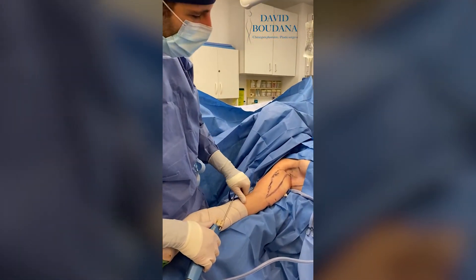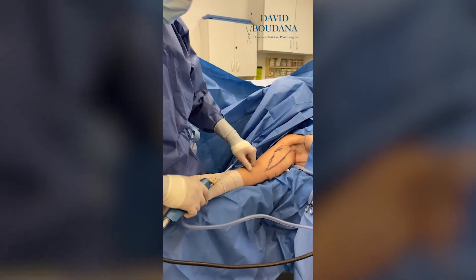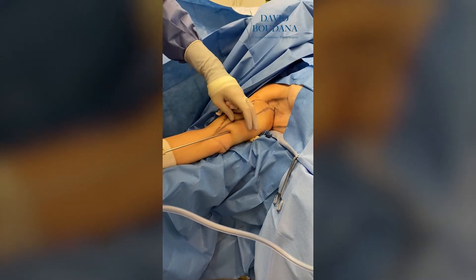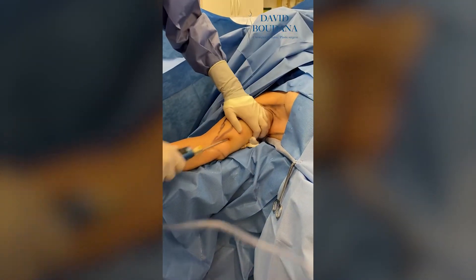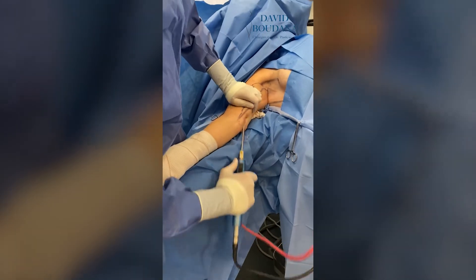This patient is now under general anesthesia and we are starting with the brachioplasty. The first step is the liposuction. We've made a small hole here in the area where we're going to do the skin excision so that we don't have a hole afterwards for the liposuction. We are removing the fat all around the arm before we do the excision of the skin.